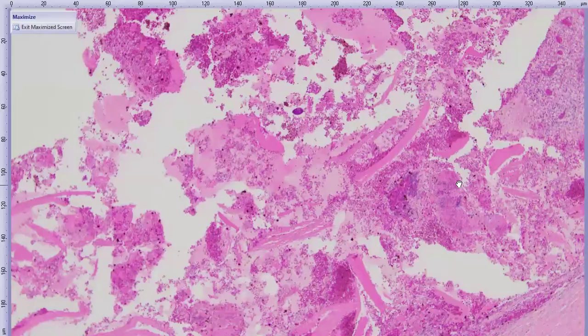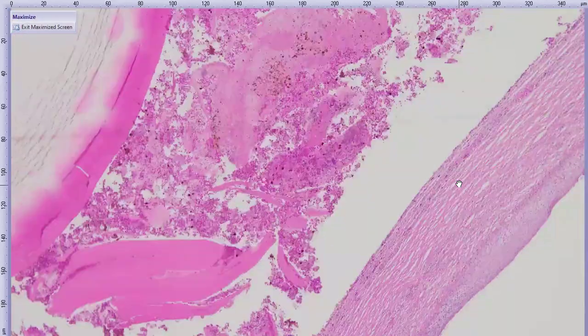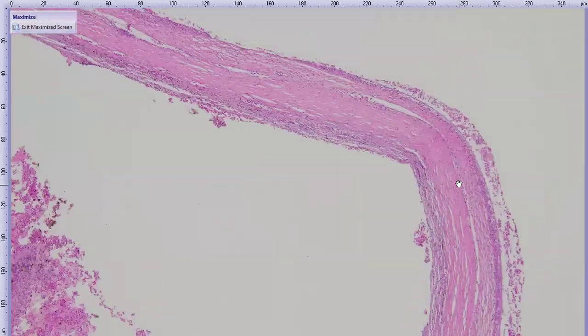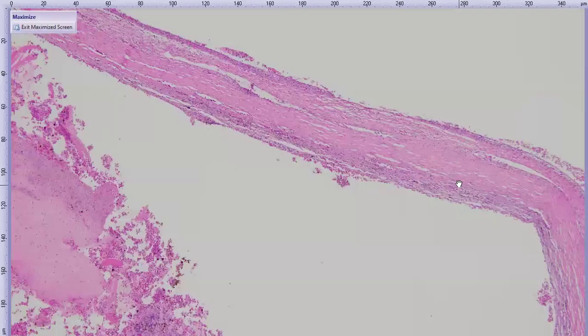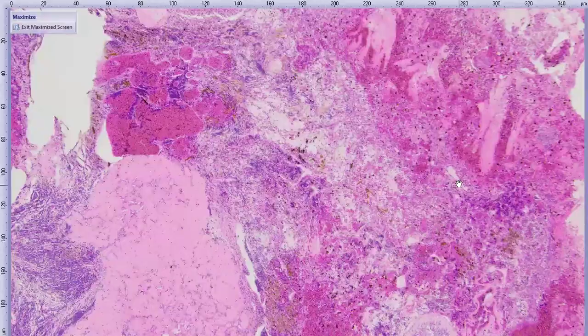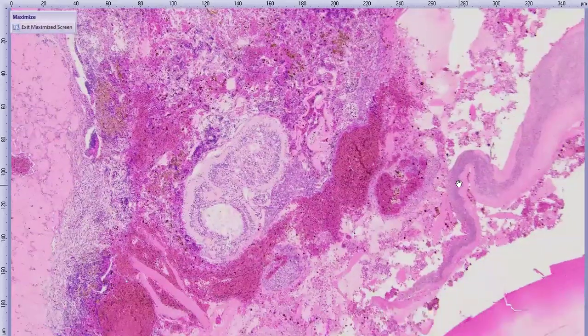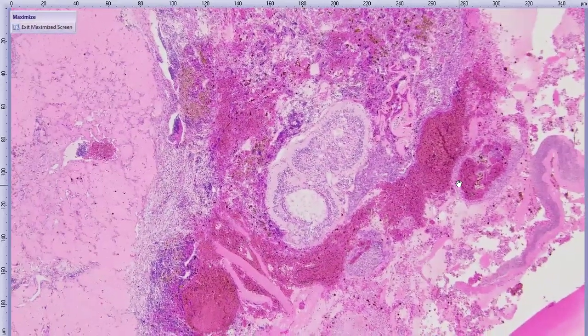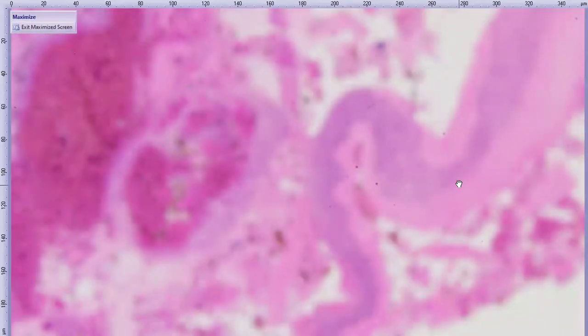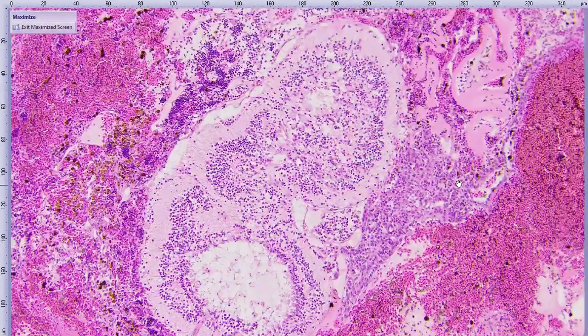So the lens is fragmented, and that suggests some degree of trauma. We do also have some significant corneal disease with ulceration and keratitis, which is probably just exposure in this case. We're not going to dwell on that. Let's see, we just saw it. Here we go. There are rarely fragments of recognizable neurosensory retina, but otherwise we don't see much of it. This is pretty much the one fragment that still looks like retina.